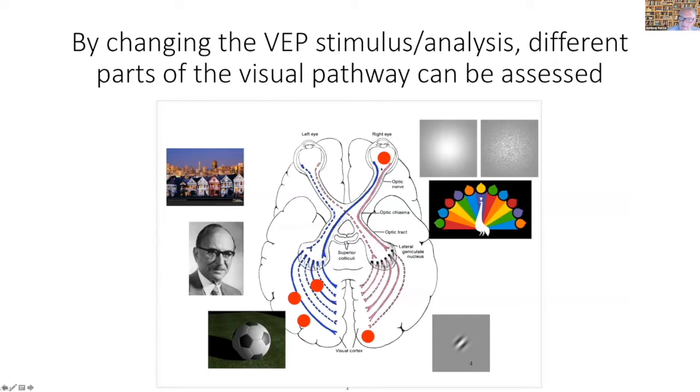So if we have an optic nerve disease, we're really interested in function here, we'll be reading it out further along the pathway after it's transited the optic nerve and the optic radiations to cortex. It's a somewhat indirect measurement, but nonetheless useful.